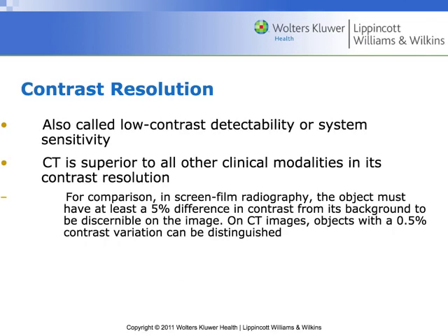Contrast resolution. We might also call this contrast detectability, but generally I call it contrast resolution. CT is superior in terms of contrast resolution to pretty much every other modality. Its ability to resolve contrast is what gives its increased sensitivity and specificity. It has higher contrast resolution than medical X-ray. It has higher contrast resolution than pretty much anything else.